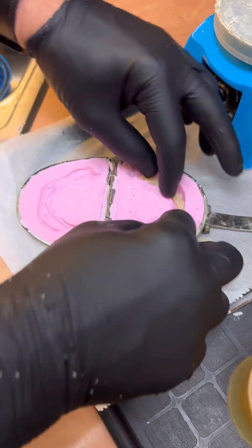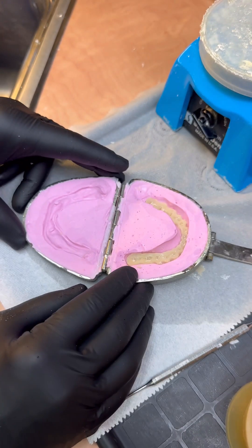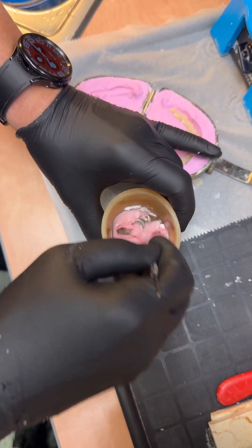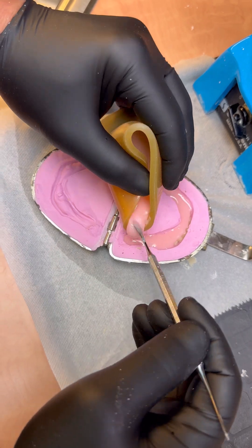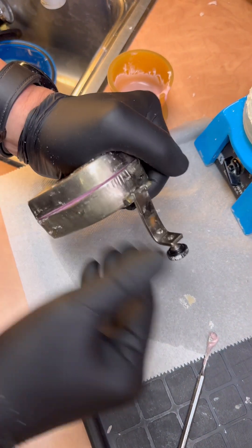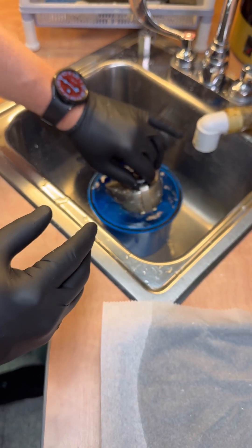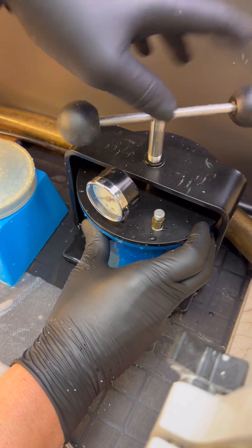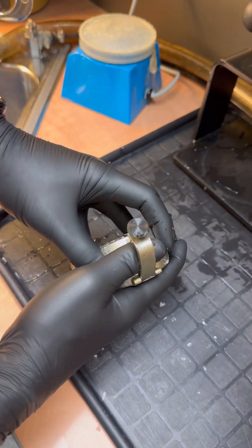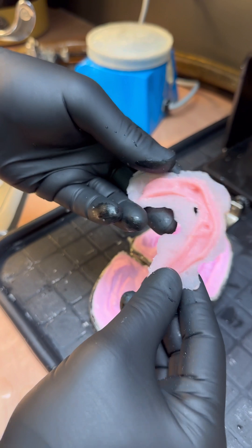Now that we've laid it into the mold, let's make sure that everything closes nicely — perfect. This is ready for the application of the pink acrylic. We're going to close the flask as tight as we can and put this back into the pressure cooker. Let's open up our pressure cooker, get our flask — voilà — and we have a beautiful duplicated denture.